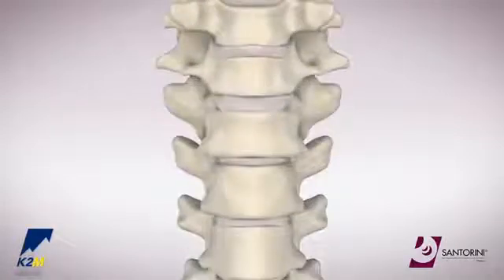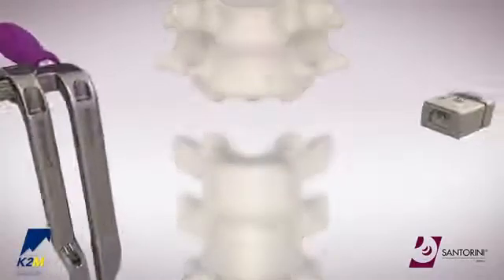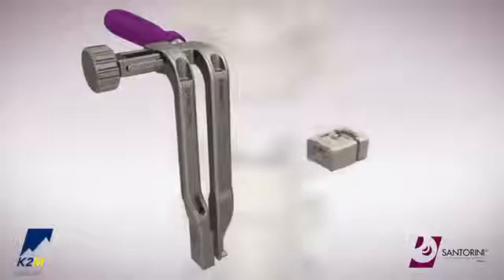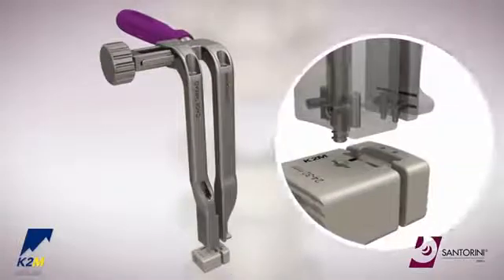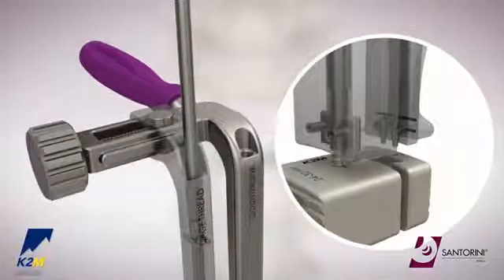Once the affected vertebrae and discs have been removed and the appropriate cage body has been selected, align the distal pins and threaded pin on the distractor with the two small pinholes and the threaded hole on the anterior aspect of the cage respectively. Engage the size 15 driver down the distractor arm that attaches to the threaded pin.